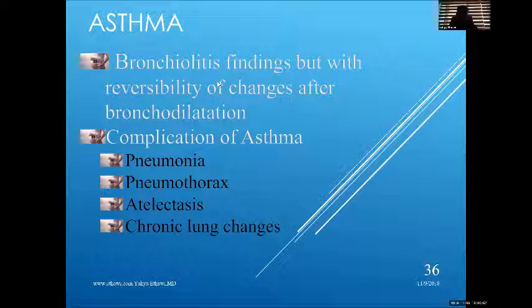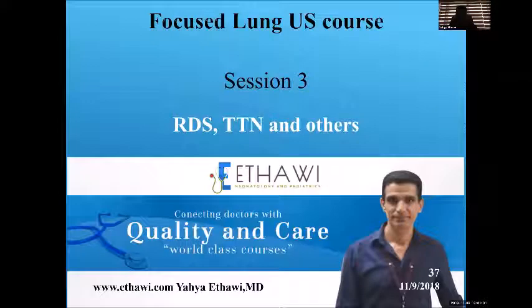And here I conclude the third and last session of the lung ultrasound about RDS, TTN, and other respiratory problems.